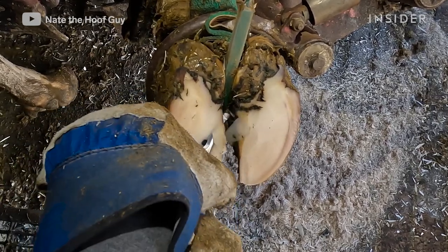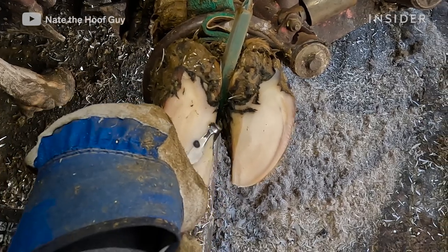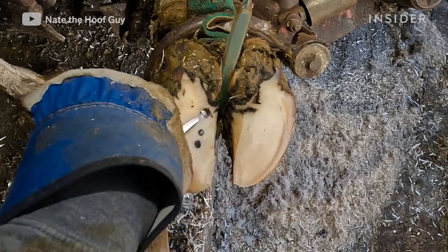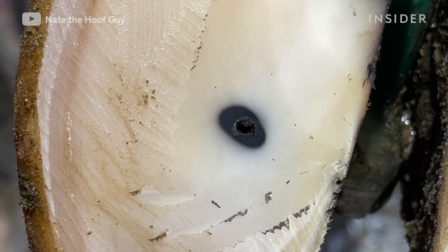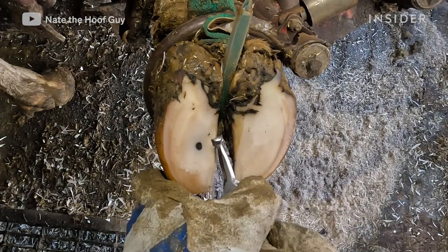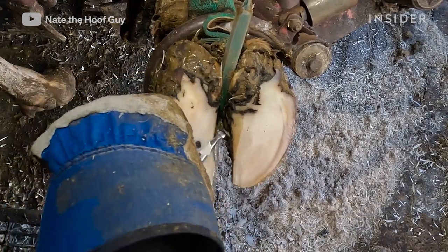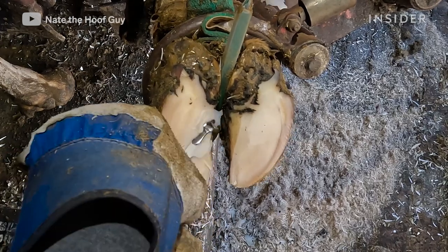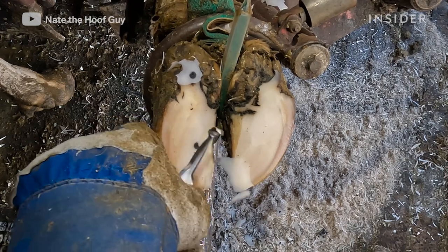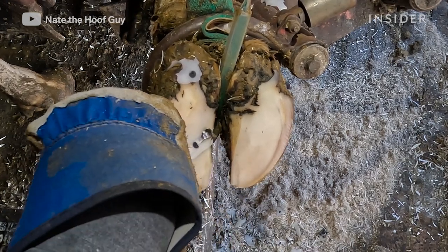The outer hoof layer doesn't have any feeling, so I can clean that up pretty safely without causing discomfort. It's the inner structures of the foot that I'm concerned about — where that screw may have poked through — that's where it would be sensitive, and when I get to those points I'm much more hesitant with my knife. That black dot that you see is a telltale sign of a puncture from something metal. What you're looking at is oxidation from the steel in the screw itself — when you see a puncture from a nail or screw you'll have a nice perfect circle right around where that puncture was.